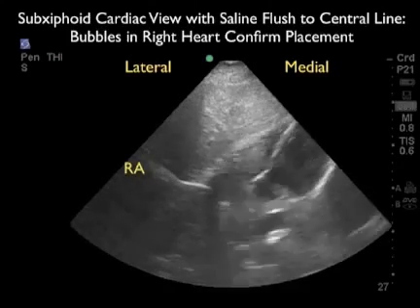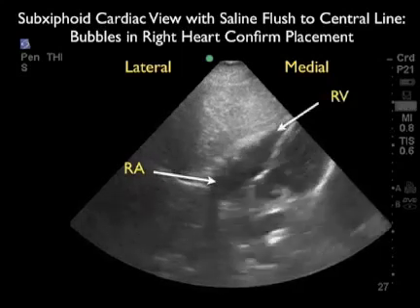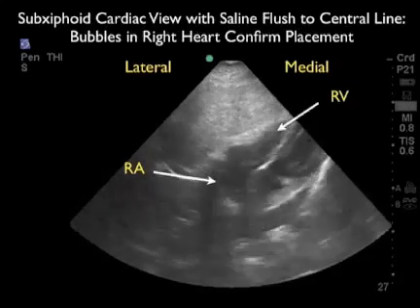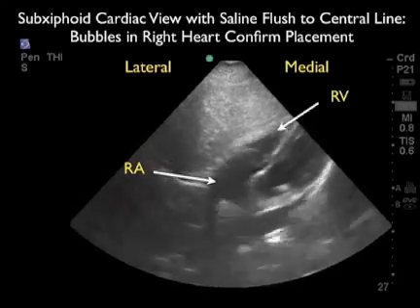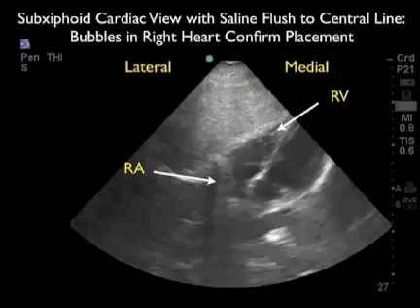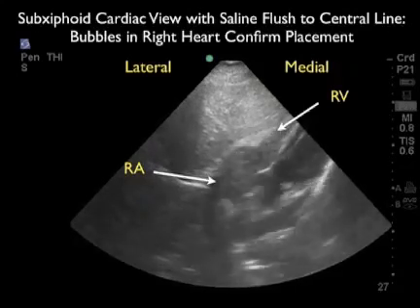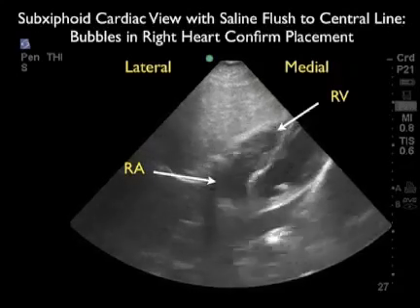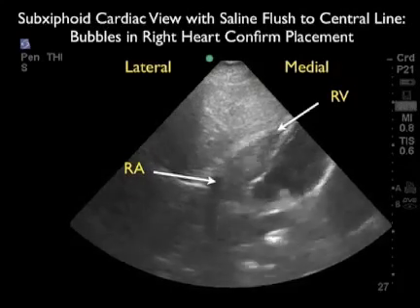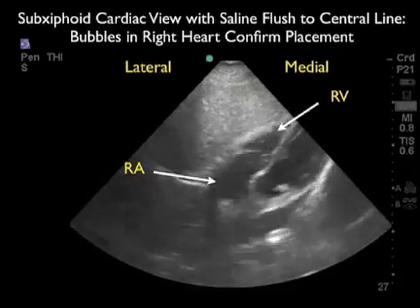While standard practice would dictate that after placement of a central line, one would obtain a chest radiograph to look for the placement of the tip of the catheter in the superior vena cava, a quick and easy way of assessing that the catheter is indeed inside the superior vena cava is to use a saline flush. Here we're flushing the saline into the catheter, and we can note the presence of bubbles within the right side of the heart, indicating that the catheter is indeed within the vessel lumen. So a quick and easy way, right at the bedside, prior to obtaining a chest radiograph.